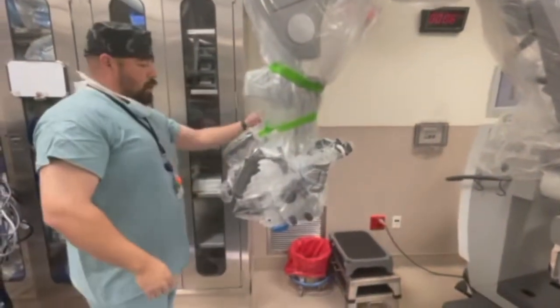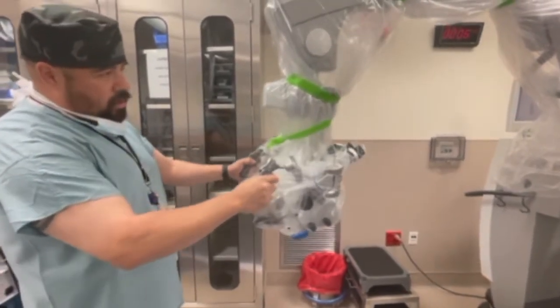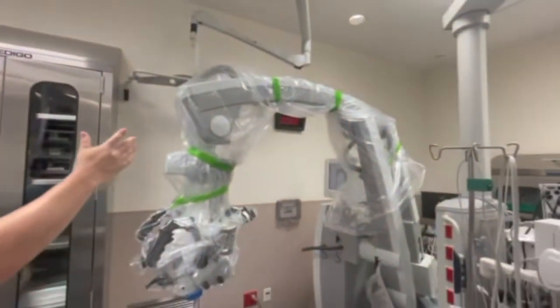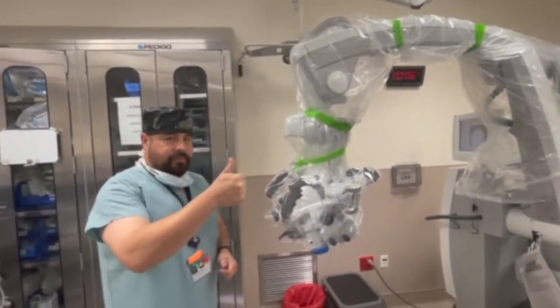The surgeon will remove the eyepiece attachments when they want to see. And you move it around and see if it's okay. I think I did a great job. So this is it, guys. This is a complete draping for the neuroscope. All right. Thank you. See you guys.